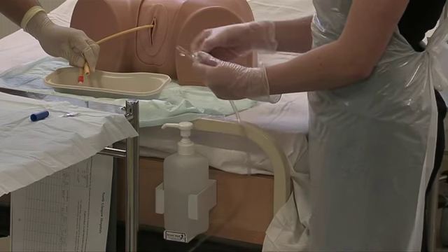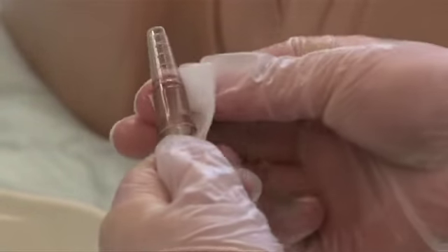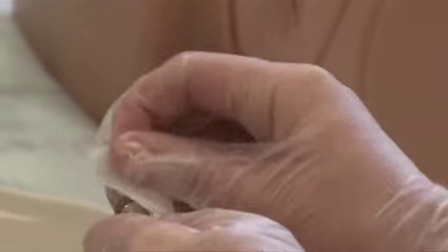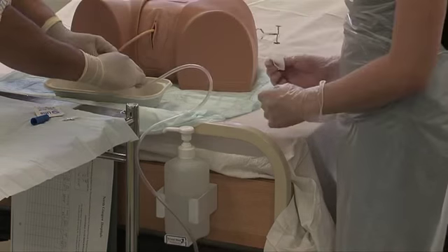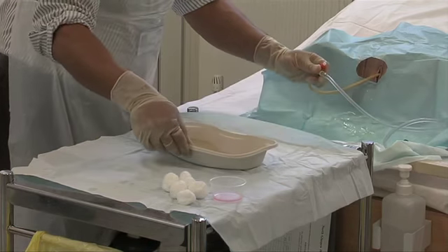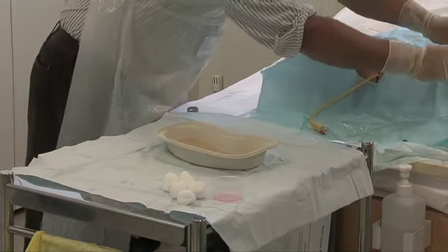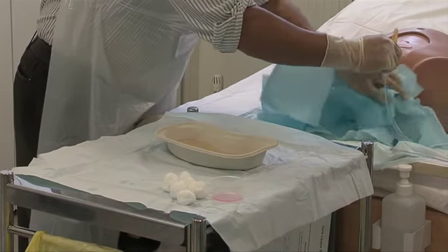Cleanse the drainage tube with an alcohol wipe and attach it to the catheter, ensuring that the bag is secured and that the tube is positioned in such a way as not to occlude the lumen. Remove the drape and dispose of as clinical waste.